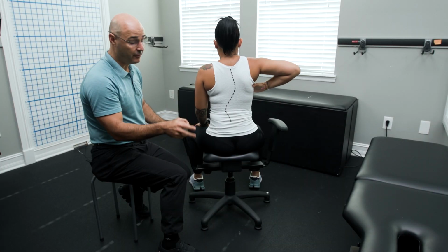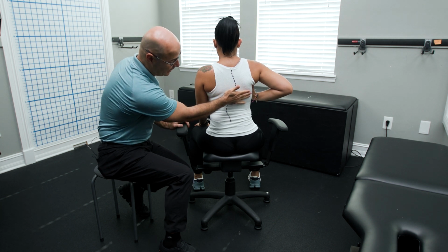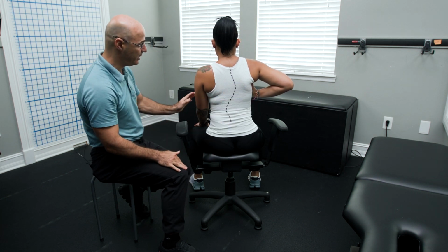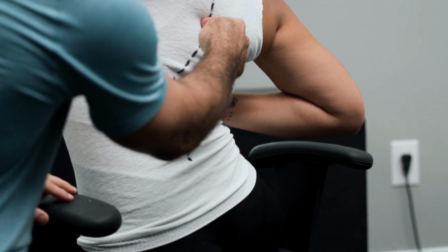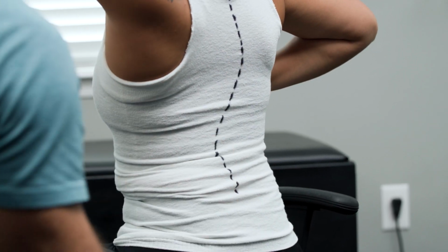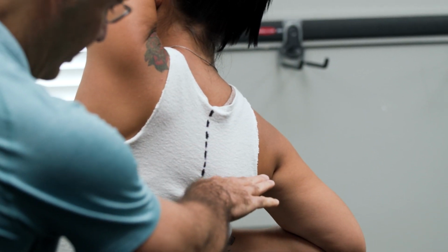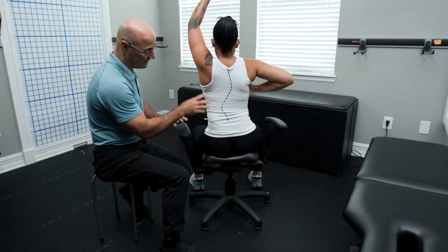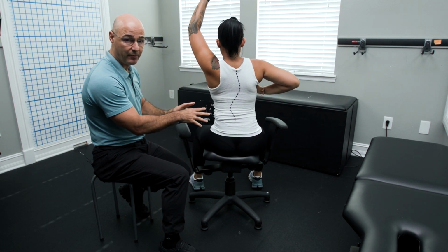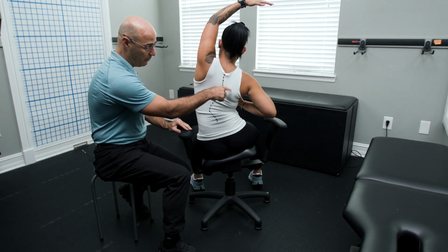Next, motion number 2 for an S curve is going to be the thoracic curve. And it's the same instruction, except now you're getting their hand really high up in their thoracic spine, arm goes up, and they flex, trying to force the movement into this area here. And you can see how with that thoracic curve, we get a decrease in that curve. Now, we know we are bending a little bit into the lumbar curve at this moment, but again, this is only a warm-up for our future therapy that's going to help increase the mobility of this area.